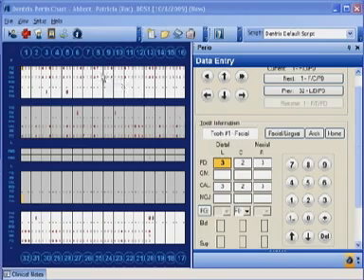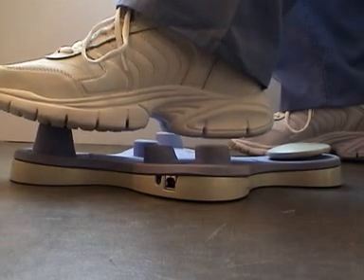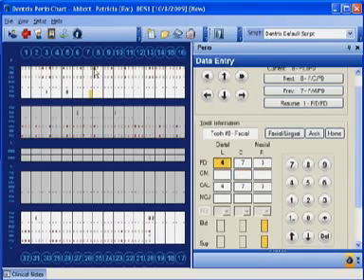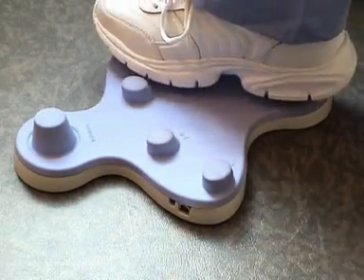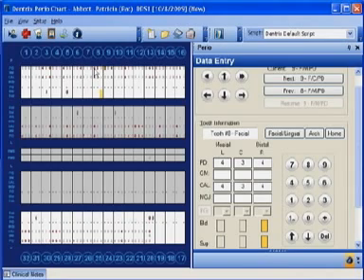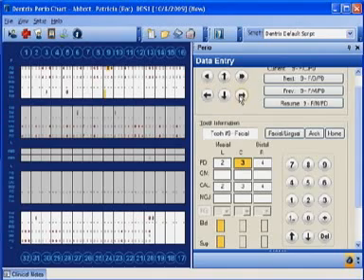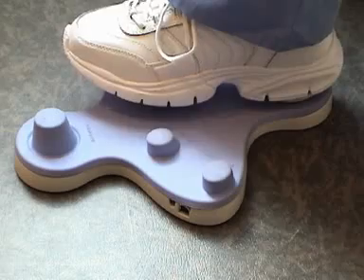You just mouse over to number 8 with your toe, and you would heel click. And let's say number 8 is now a 434. You would just enter your 434, or you can put your mouse on the forward buttons here, and it will auto advance just by heel clicking. So you can do a quick update that way. Maybe all the others are the same, and then you just need to go enter a 442.